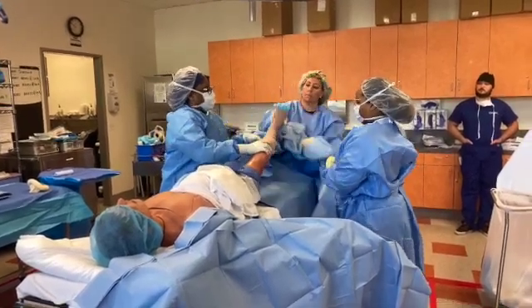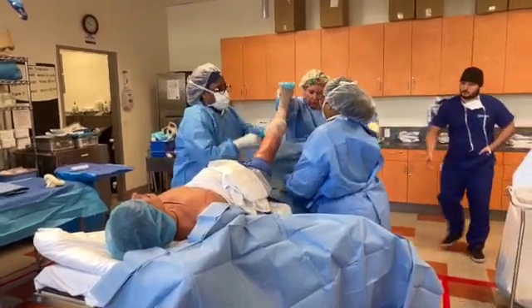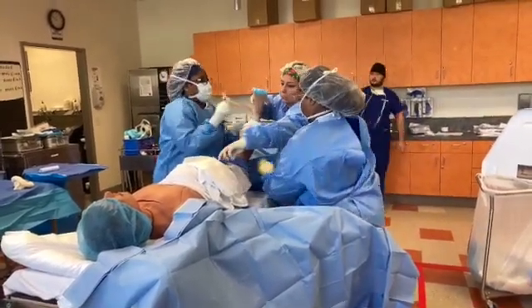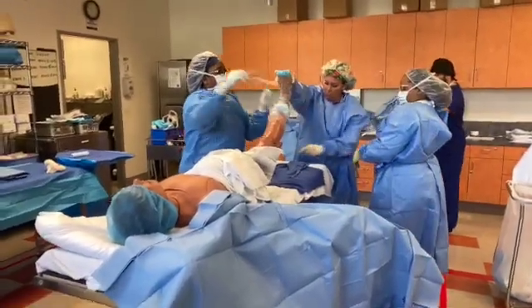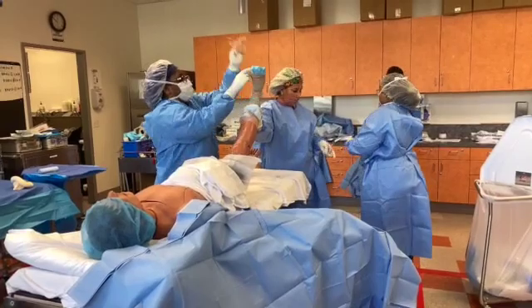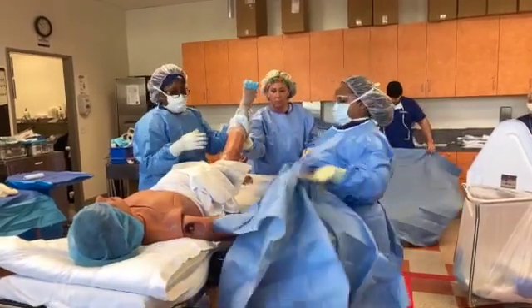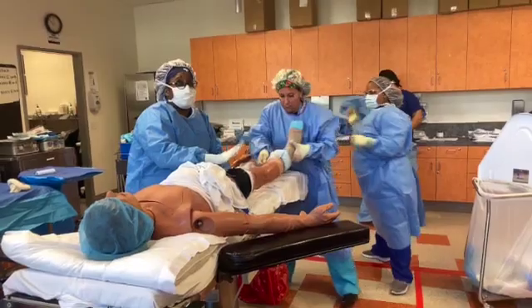Bree, you gotta get rid of that stuff. So we're working as a team. You see how fast I'm moving? There's still more stuff where you gotta, it's all about watching, helping, okay? This is where we're helping each other. No one's just standing around. You see how Ms. D just adjusted? Sometimes we cut scissors. Sometimes we'll just take scissors. Take it all off. Now, to take off this tourniquet, tourniquet's already deflated.